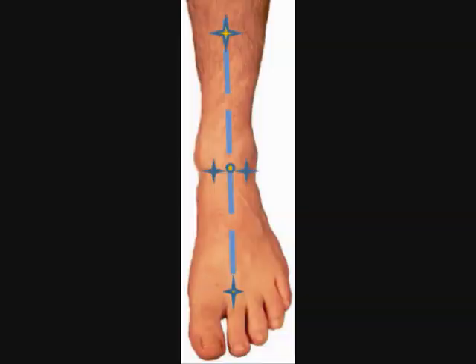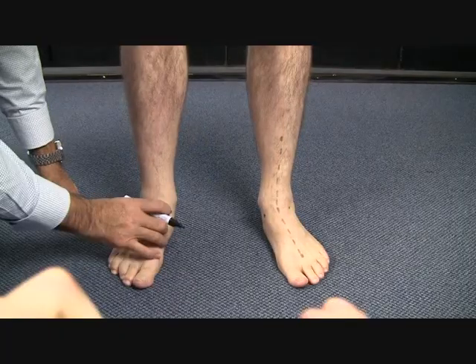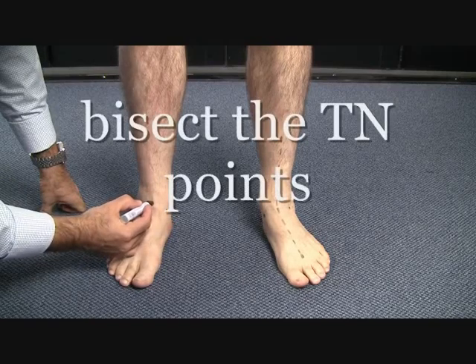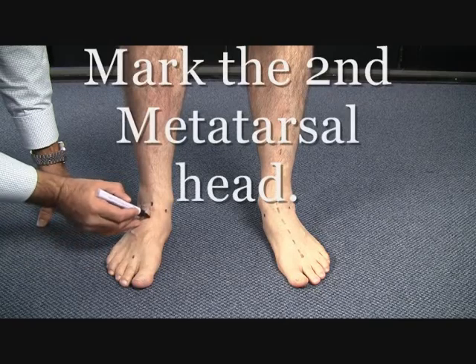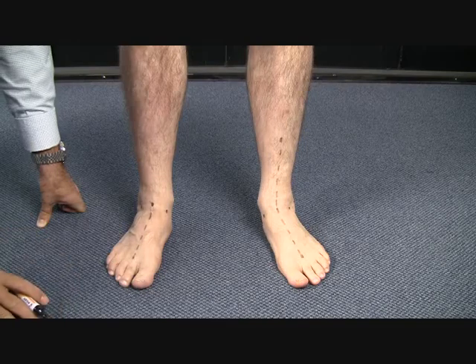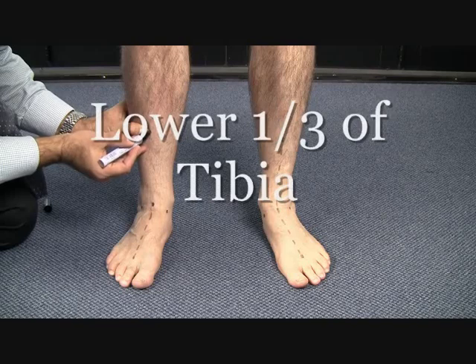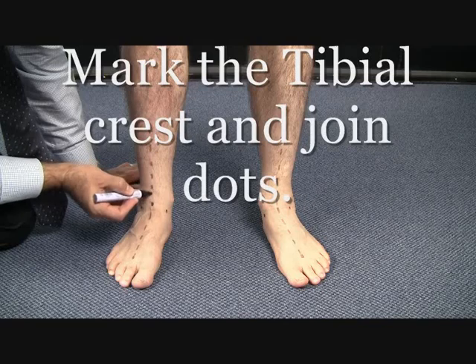The key reference points for the ALM are outlined in the photo. Start with the talonavicular reference points, lateral and medial. Bisect the talonavicular points. Mark the head of the second metatarsal joint and join with a dotted line. Locate the tibial crest on the lower one third of the tibia and draw a dotted line to the talonavicular bisection point.